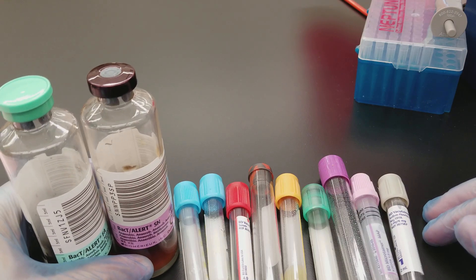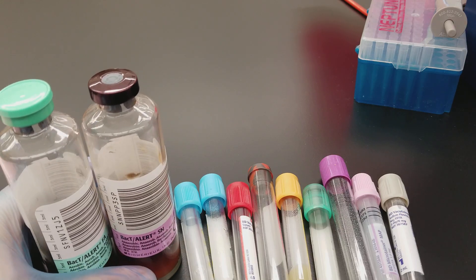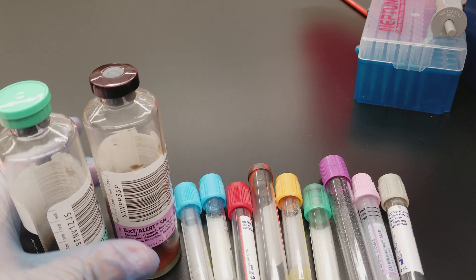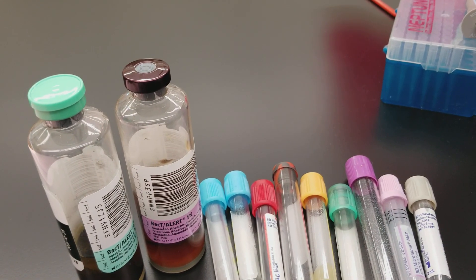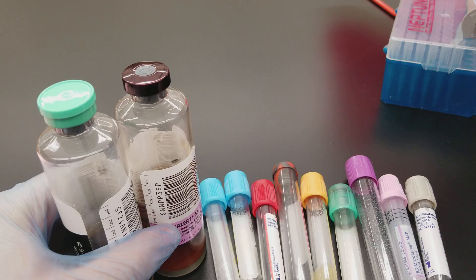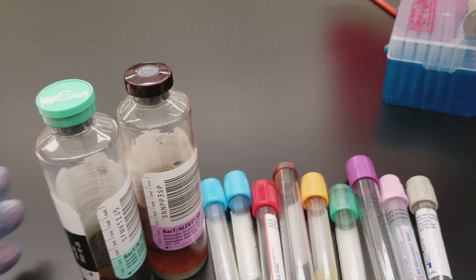So when you're going to draw a specimen from a patient and they require a blood culture bottle, it's because they are thought to have septicemia, which is an active growing of bacteria in the patient's blood. It is very deadly and a very serious condition. So we draw the blood culture bottles to actually try to grow them, then plate them and perform a gram stain on them if they're positive.